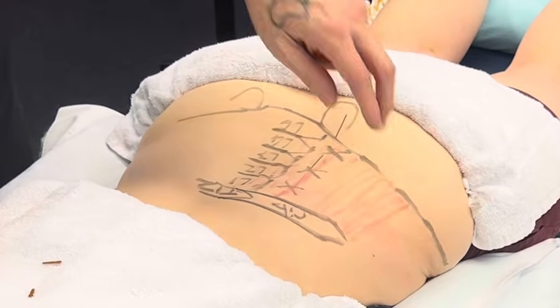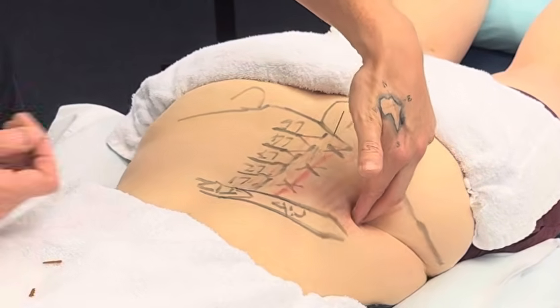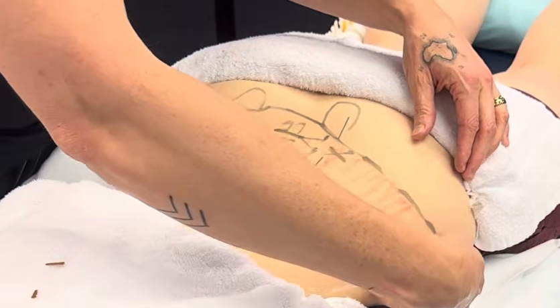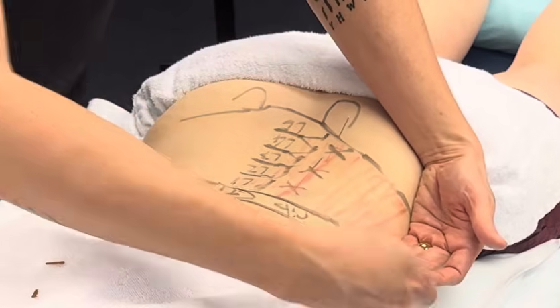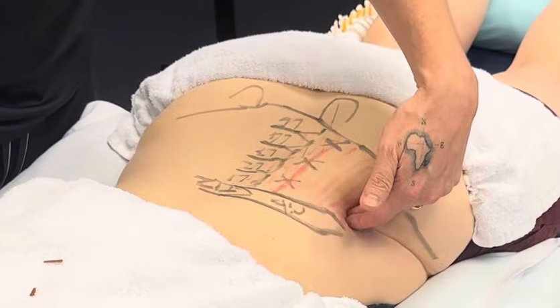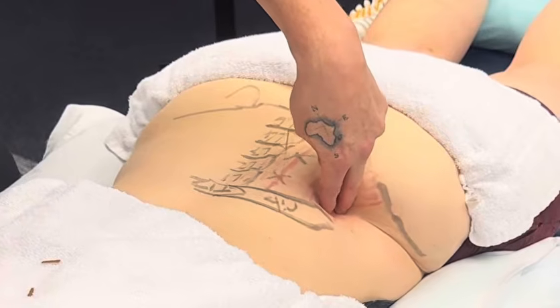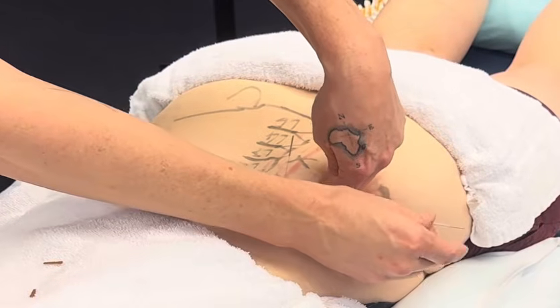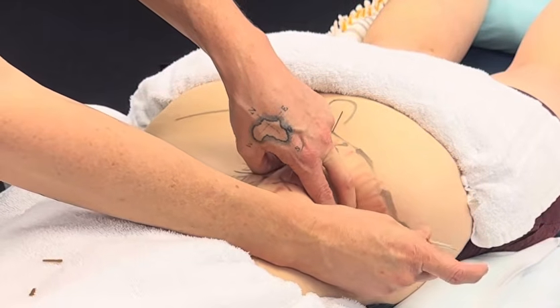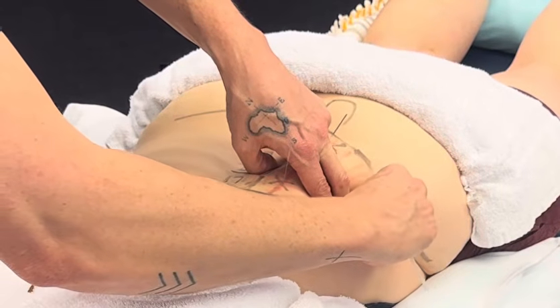Okay, so for QL, once again, I want to press onto it. If you divide the body in half, probably you're safe at the halfway line, but I might come a little bit above that. And definitely you want to feel that muscle. So if you're not feeling it, then you got to get somebody. I can feel it there. So I'm just going to bracket on that muscle. We want to go straight medial to lateral. Oh. And there's a bony end-feel.